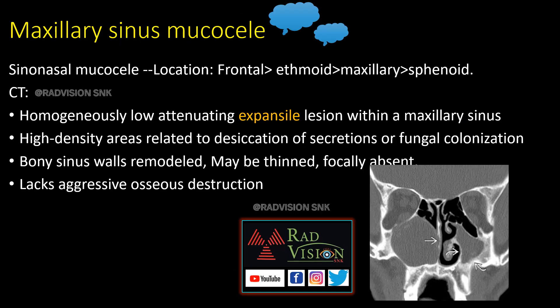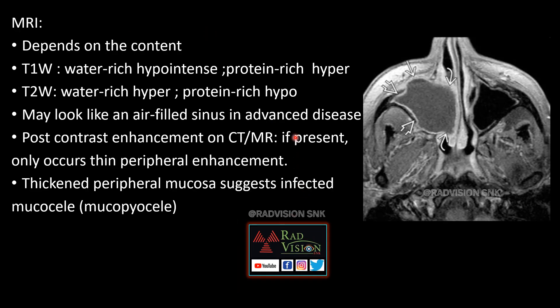Maxillary sinus mucocele is a homogeneously low-attenuating expansile lesion within the maxillary sinus, giving a clouding appearance of the adjacent bony structures, with hyperdense areas related to desiccation of secretions or fungal colonization. Bony sinus walls may be thinned, remodeled, or focally absent, but lacks aggressive osseous destruction. On MRI, it is T1 hypo-intense and T2 hyper-intense if water-rich, or T1 hyper-intense and T2 hypo-intense if protein-rich. Post-contrast shows only thin peripheral rim enhancement. Thickened peripheral mucosa suggests infected mucocele (mucopyocele).